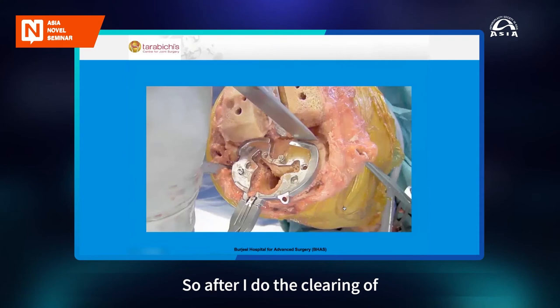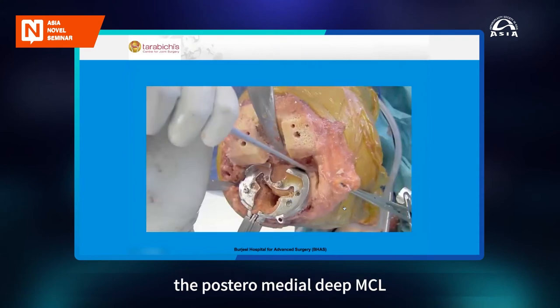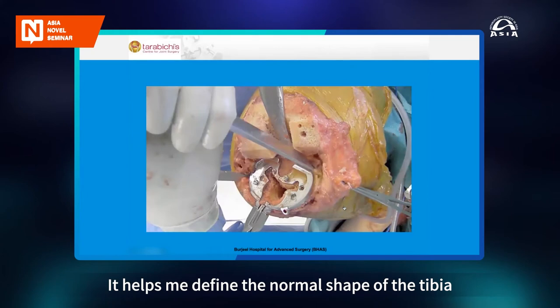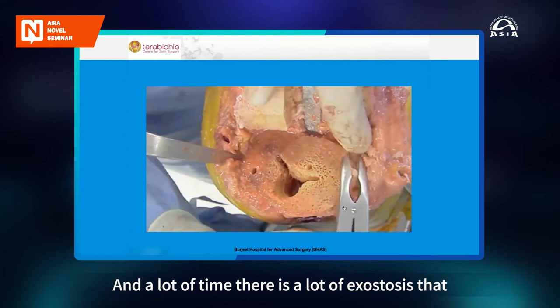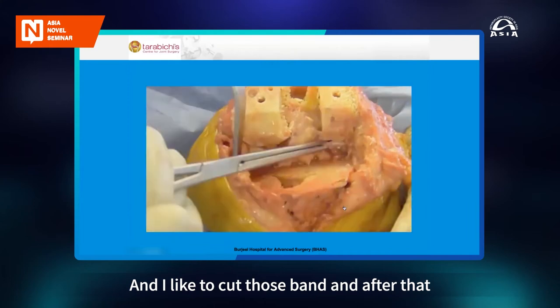So after I do the clearing of the posteromedial deep MCL, then sometimes I use the anatomical tibial tray. It helps me define the normal shape of the tibia. And a lot of times there is a lot of exostosis that you have to excise. And I like to cut those bands.